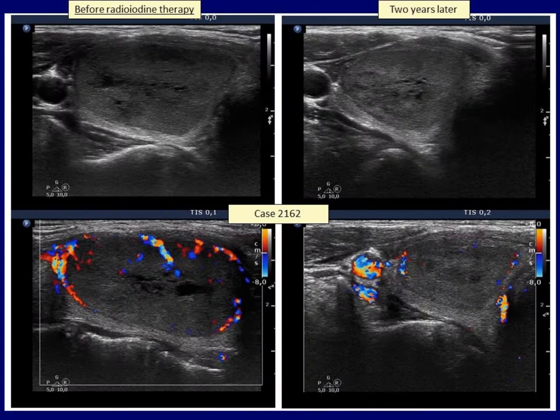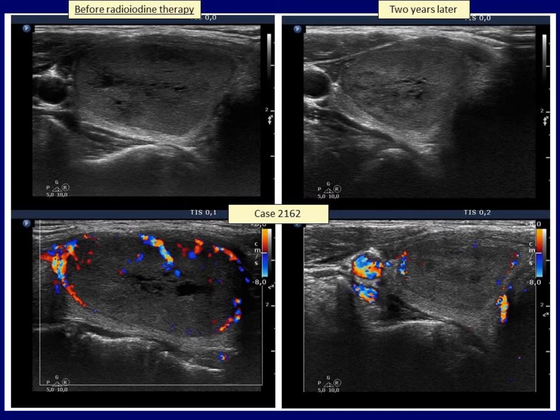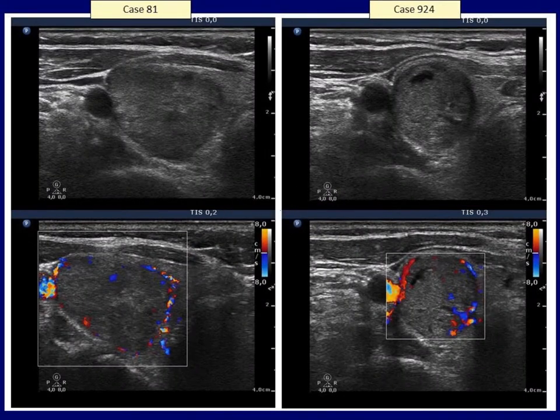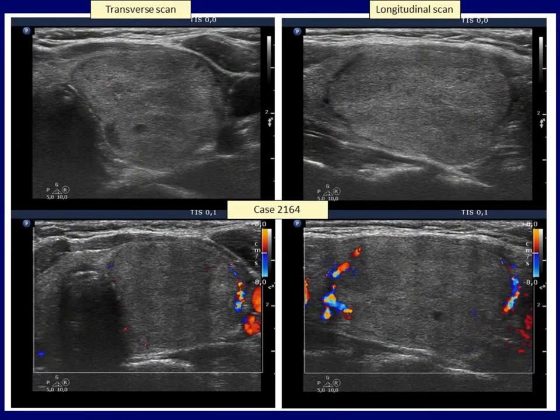I present an autonomously functioning adenoma: left image before radioiodine therapy, right image after the treatment. The presence of perinodular flow is obvious before the therapy, while after the therapy the degree of perinodular flow became lower than 25%. In this follicular cancer case, the presence of halo is obvious while the perinodular flow is observed in less than 25% of the circumference.